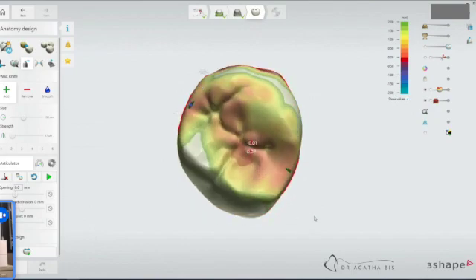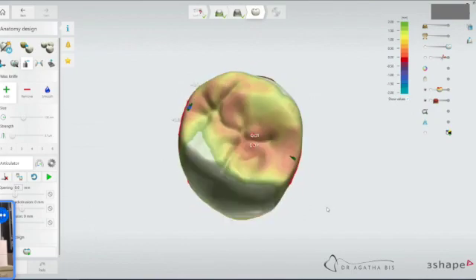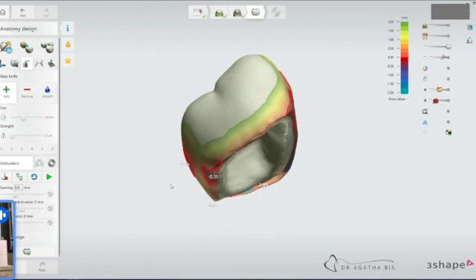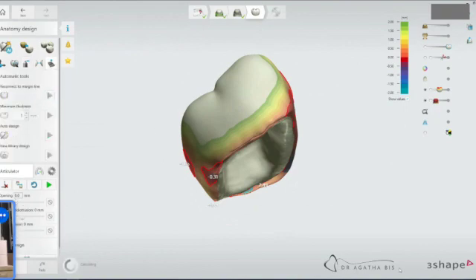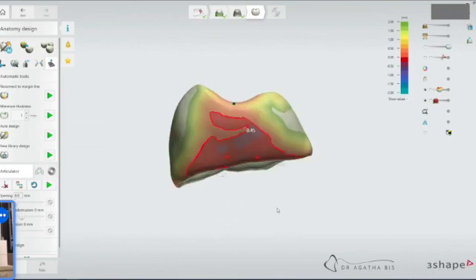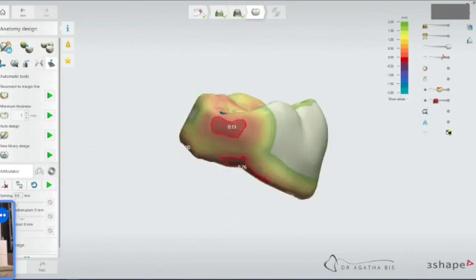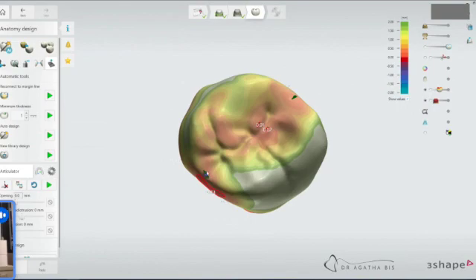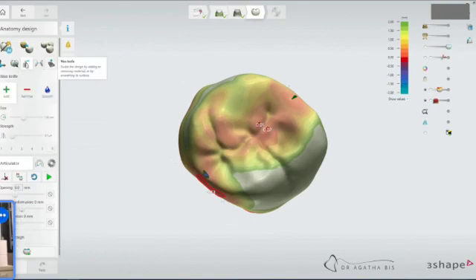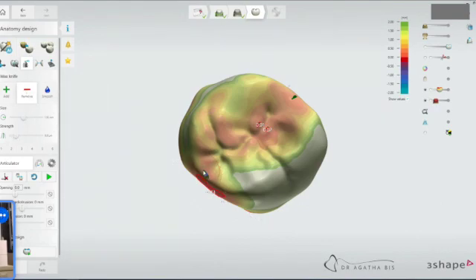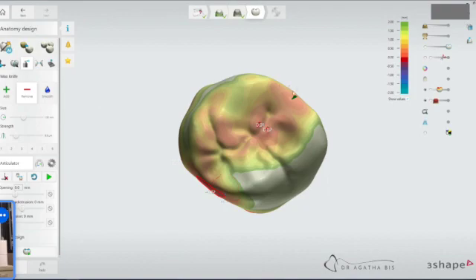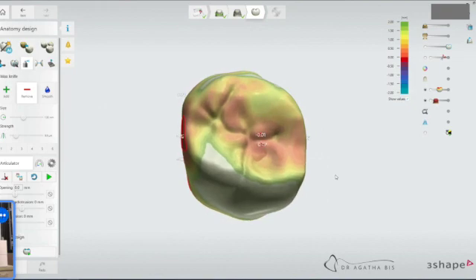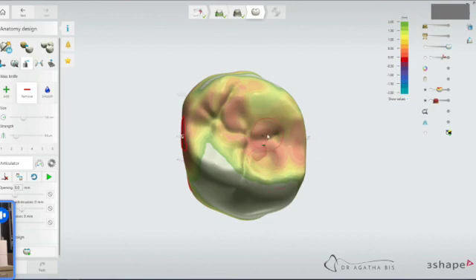And then we're going to actually pull through and reconnect again to the margin line. I want it smooth flowing through. So now we're going to eliminate these areas. I'm going to go back to the wax knife, remove. We're going to go small size, very little strength. We're just going to shave it a tiny bit, eliminate that and that. Good. Then you could potentially eliminate that. And then you just really have a very solid area. This is showing you that it's thin.